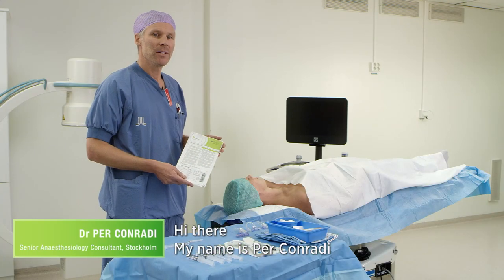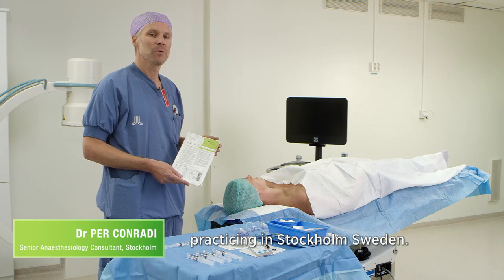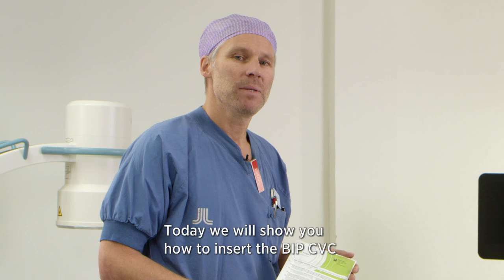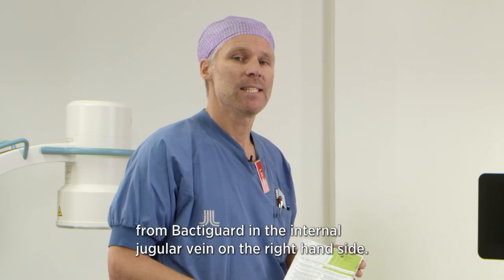Hi there, my name is Per Conradi. I'm a senior anesthesiology consultant practicing in Stockholm, Sweden. Today we will show you how to insert the BIP CVC from BactiGuard in the internal jugular vein on the right hand side.